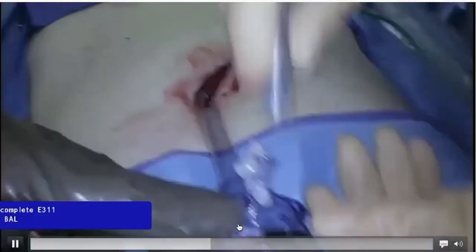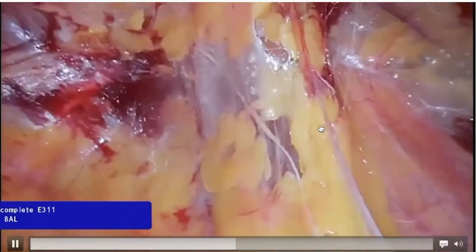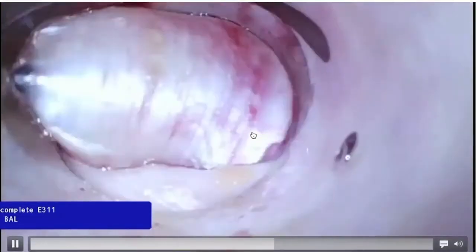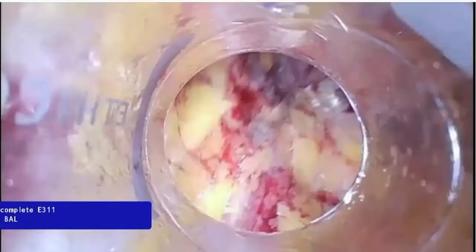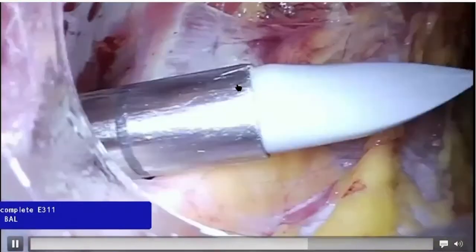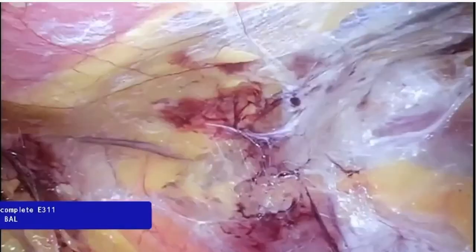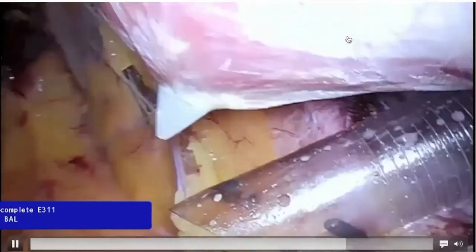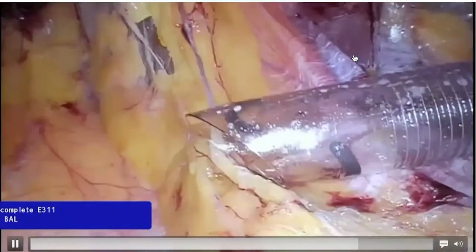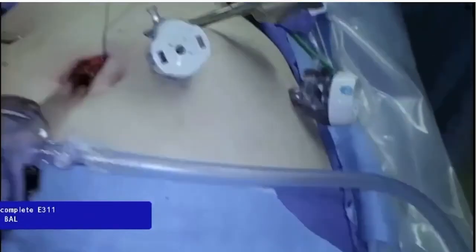The smooth trocar is used to create the space by going next to the muscle and pushing the peritoneum cephalad to allow placement of the assistant trocars. Here on the left side, just behind the epigastric vessels, the left robotic ports are being placed. Once that is done, I normally use a needle to help stay away from the epigastric vessel — to chart the course of the trocar and avoid epigastric injuries. It's a very safe, reliable way of getting access, and this is a six-port configuration.